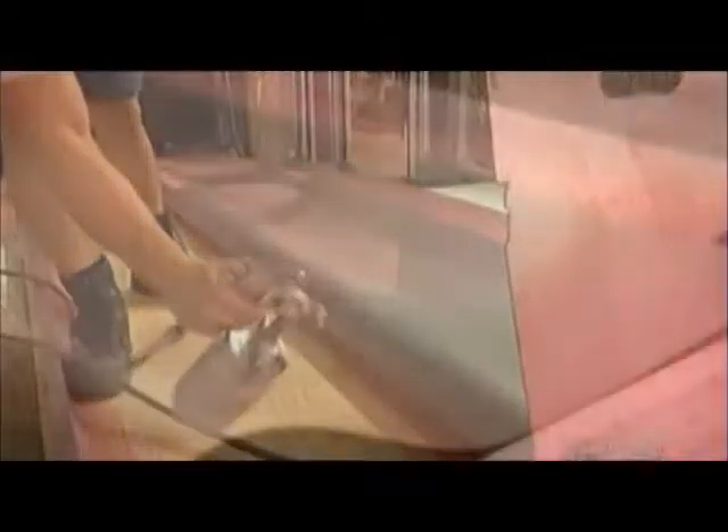Now they spray glue on the back of sheet vinyl. This highly durable antibacterial flooring goes on top of a plywood subfloor they've installed on top of the truck's aluminum floor.